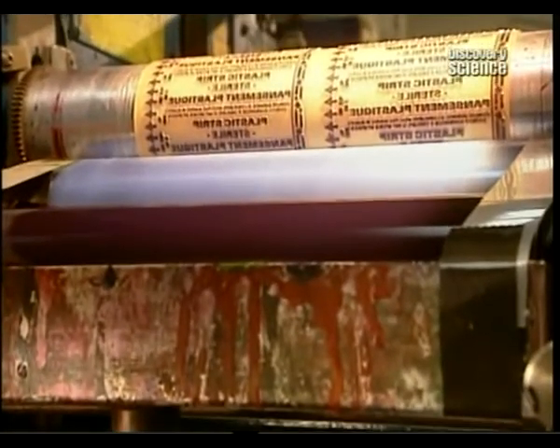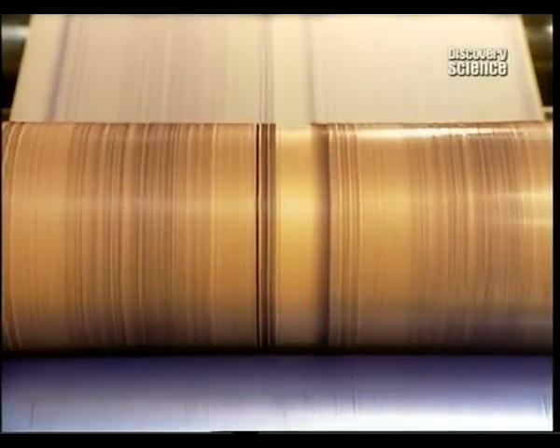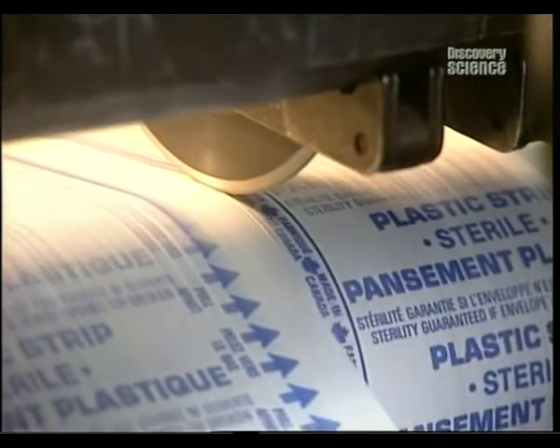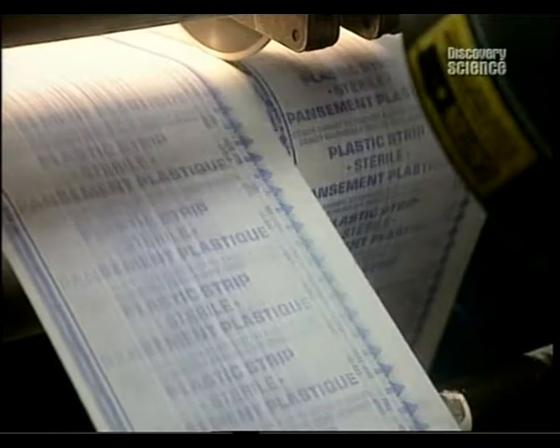Sometimes instructions are printed onto the plaster wrappers. 2 polymer plates receive ink from a series of rollers in order to reproduce the desired design. The plasters pass through at incredibly high speeds. Before being packaged, they're finally sterilised, 10,000 at a time.